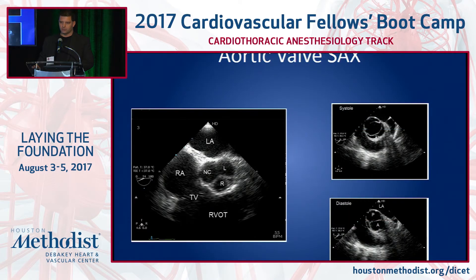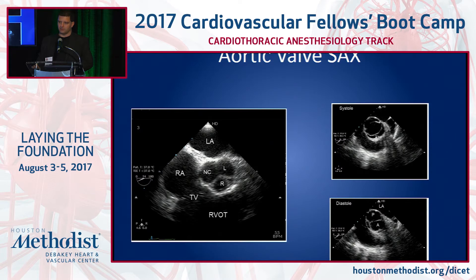Short axis view again. You have the normal valve on the left, and you have the bicuspid in diastole and systole on the right-hand side, just to see the difference between a normal valve with three cusps as opposed to the bicuspid valve with only two cusps.